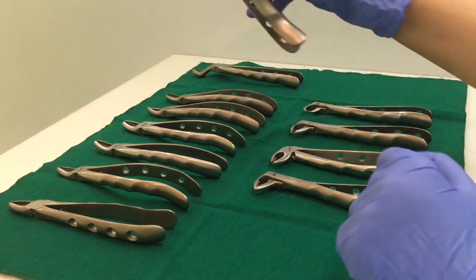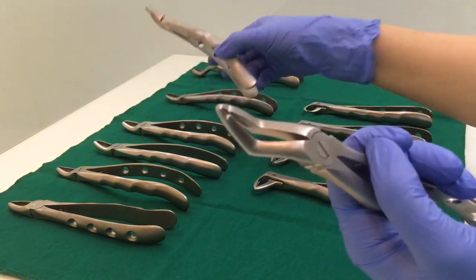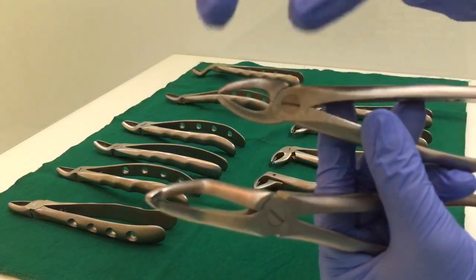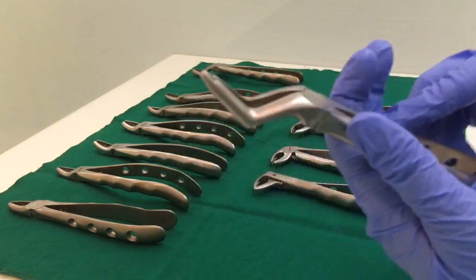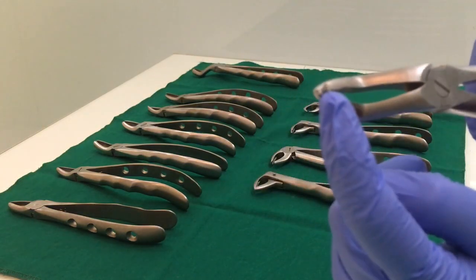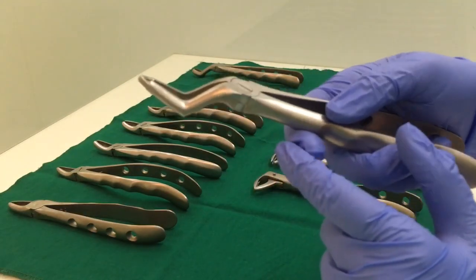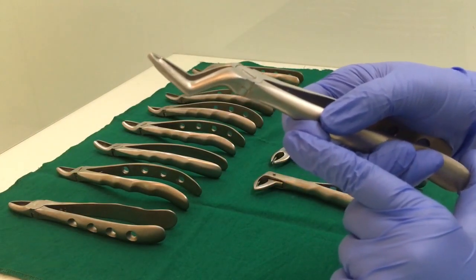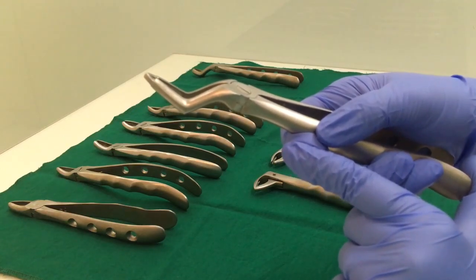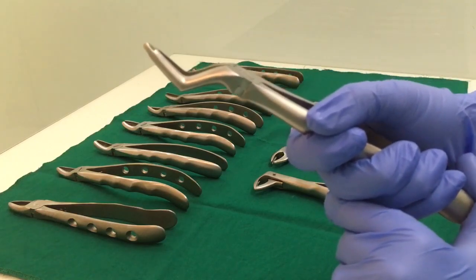Now let us move on to the upper root forcep. The upper root forcep will have a long beak — longer than the other ones. That is the main differentiating feature because the beak has two angles. Also, the beaks meet at the end with no gap in between. These are used for removing upper roots — it can be used for the root of any upper tooth, whether incisor, canine, premolar, or molar. This is also known as bayonet forceps.